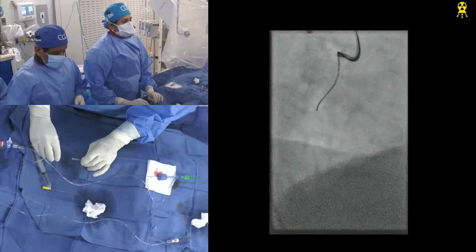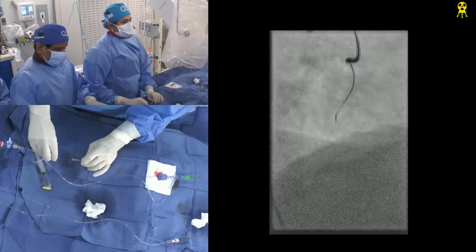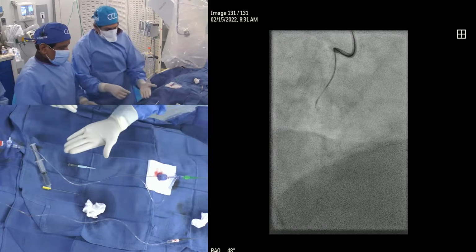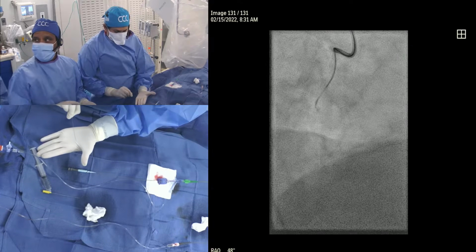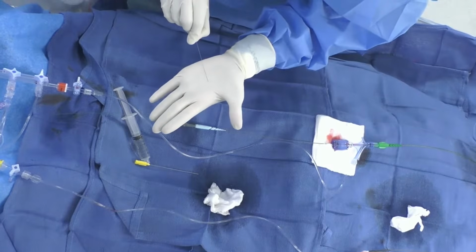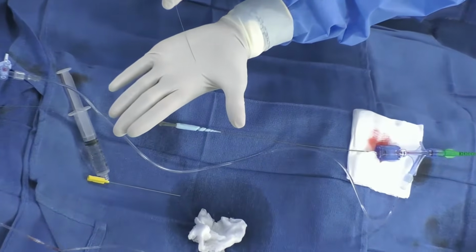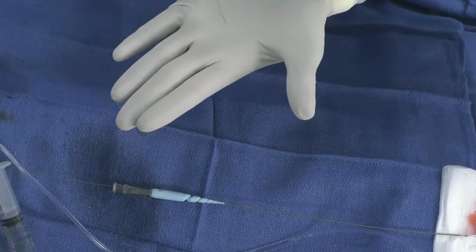Yeah, 3. And then they want to see, put on the hand with a small tip, which is already there. So if you can see here, the tip. Yeah, they can see. Do you need a blue background? See it a little more if we can focus. Perfect. Excellent. Yeah. A very small tip.